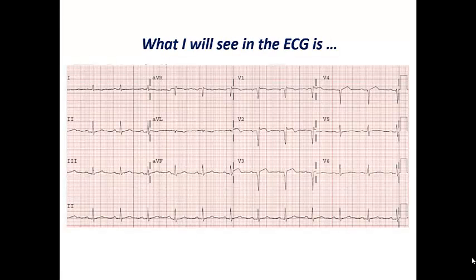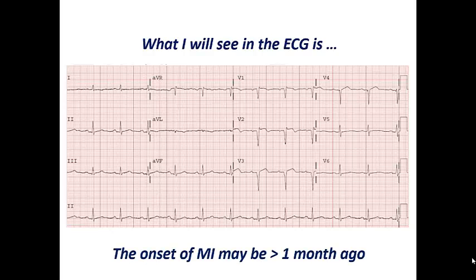For example, in this ECG I can see ST elevation in V1 to V4. When I ask about the onset of MI and I know it was more than one month ago, in this case I would assume that this patient may have an aneurysm in the wall corresponding to the lead territory, so I can expect an apical LV aneurysm or aneurysm in the anterior wall.